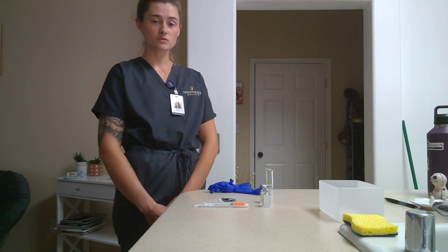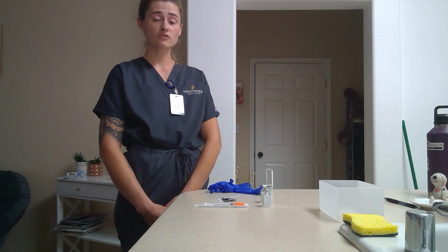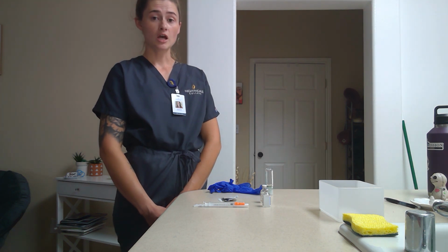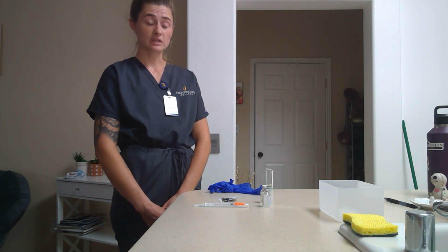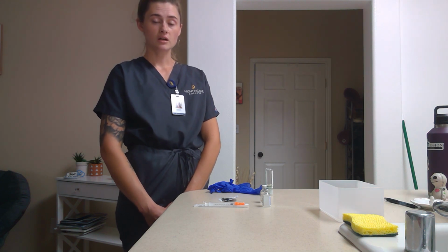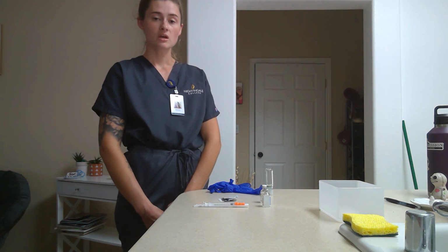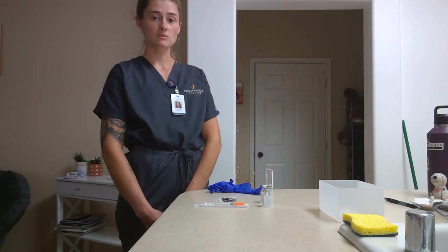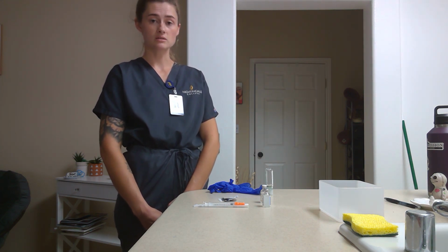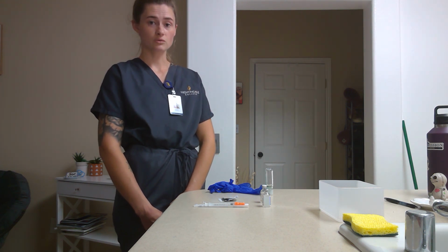I'm going to introduce myself, tell them that my name is Madeline, I'll be their nurse today. After I have told them that, I am going to ask for 2 forms of identification, first and last name and date of birth. Once they have verified that, I'm going to ask them if they have any known allergies. This could be allergies to medications, to food, etc. Once they have verified that, I'm going to explain to them that I will be giving them a subcutaneous injection of insulin, which I will compare to my electronic health record.